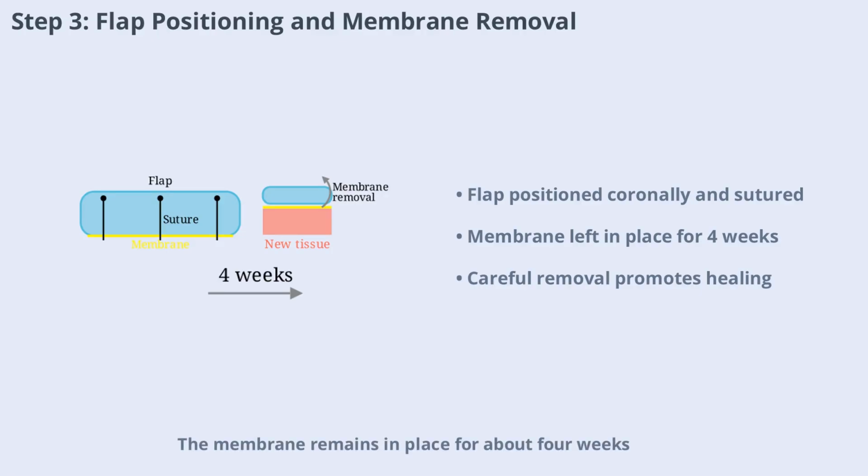The membrane remains in place for about 4 weeks, during which time new tissue begins to grow beneath it. After this period, the membrane is carefully removed without disturbing the delicate, regenerating tissue. This step is critical for ensuring optimal healing and successful tissue regeneration.